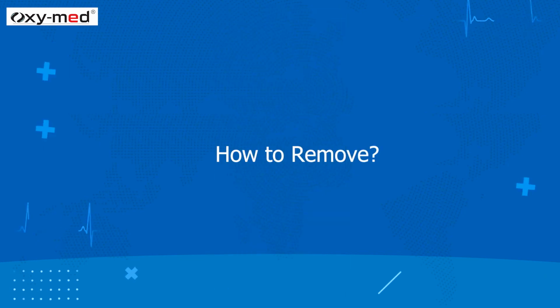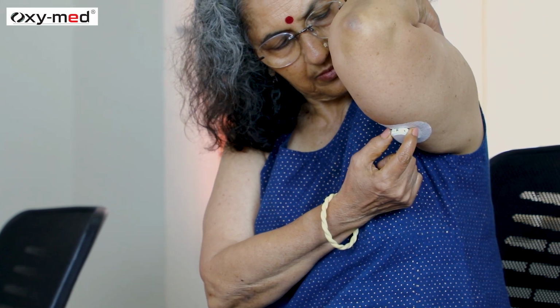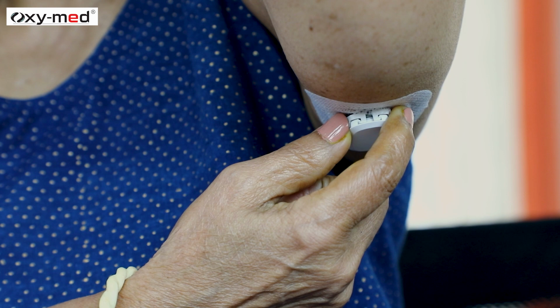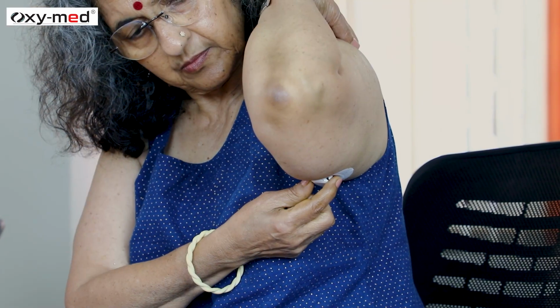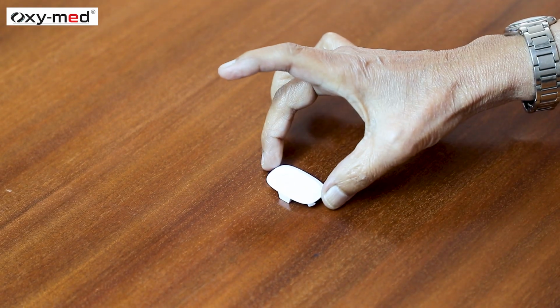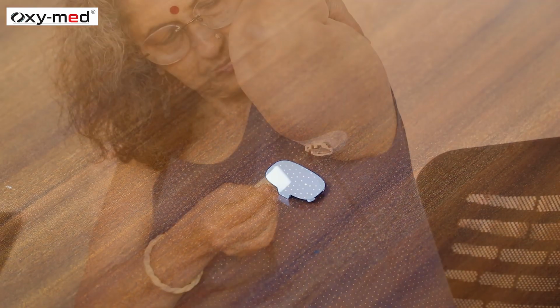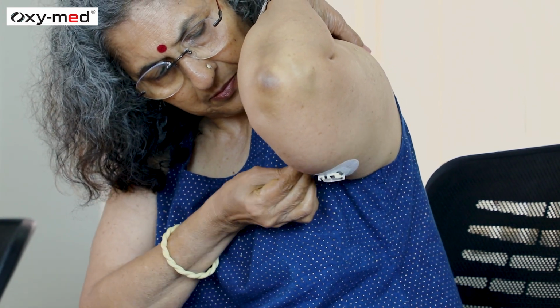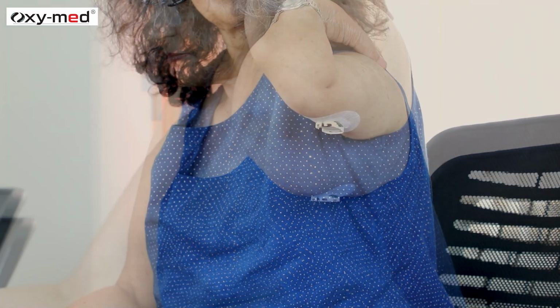Now let us see how to remove the sensor from your body. Press the 2 release buttons on the sensor base to detach the transmitter. Your transmitter is reusable, please do not discard it. Use 1 alcohol pad to wipe the edge of the adhesive patch before peeling it off.